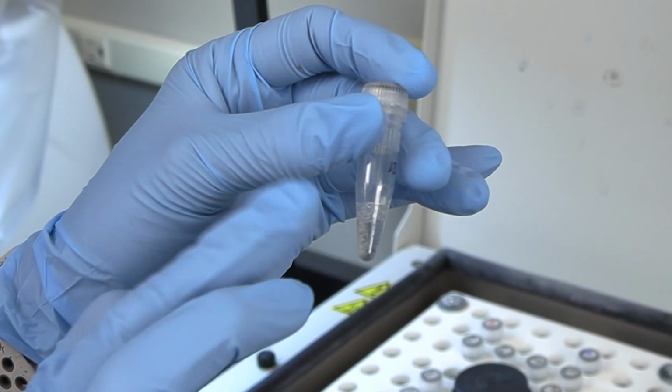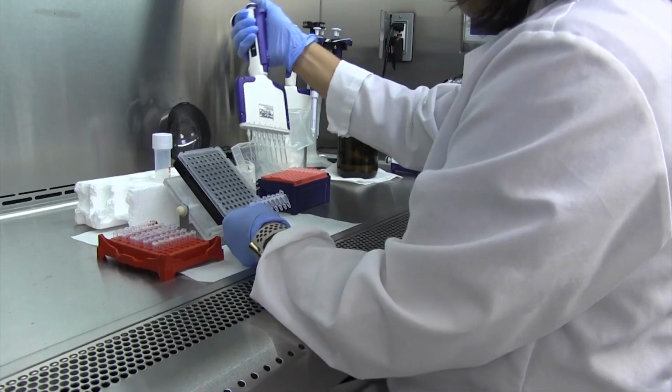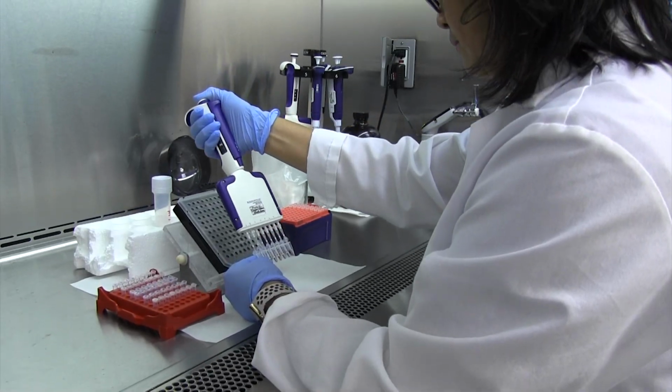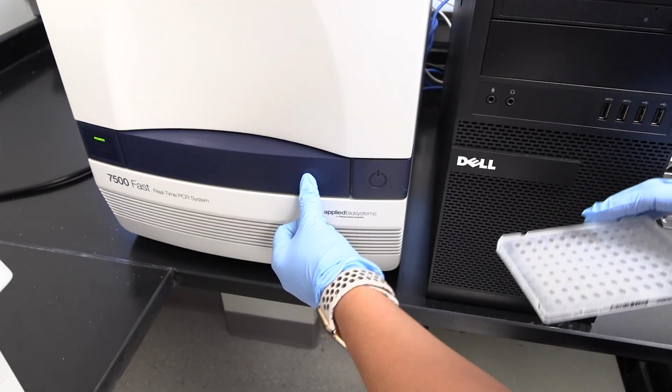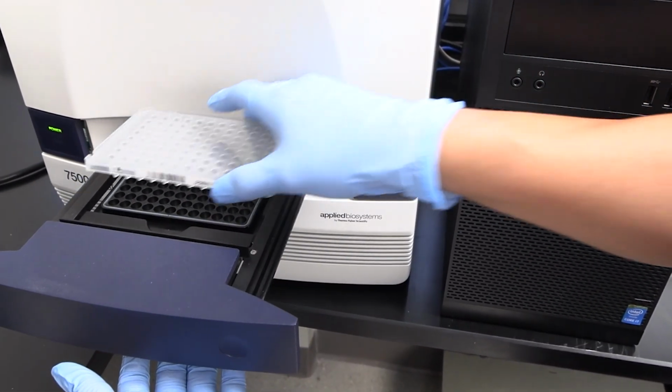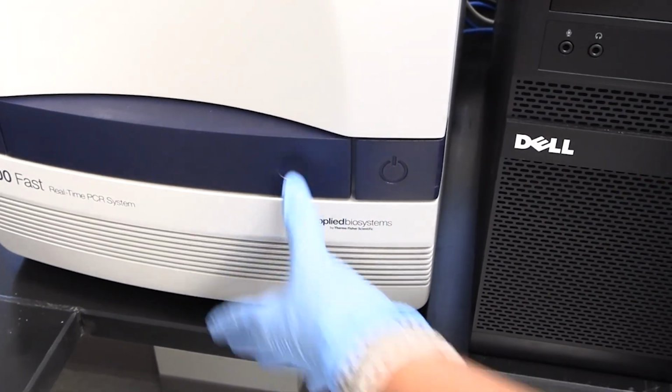quantities of M. leprae and M. lepromatosis DNA in tissue samples. Using bacteria-specific reagents, the PCR process can amplify specific portions of bacterial DNA from a very small sample, allowing us to detect the presence of Hansen's disease-causing bacterial DNA in the original tissue sample.